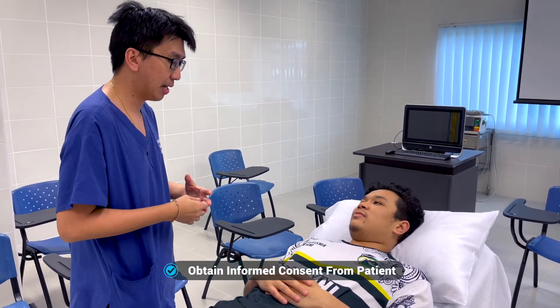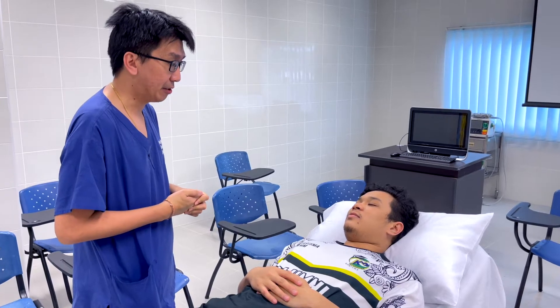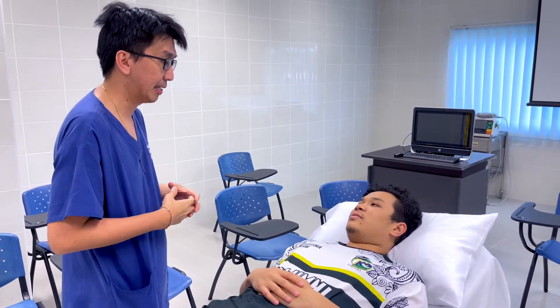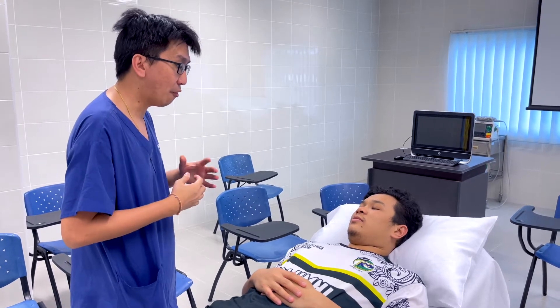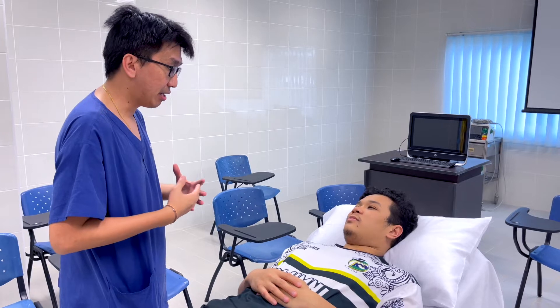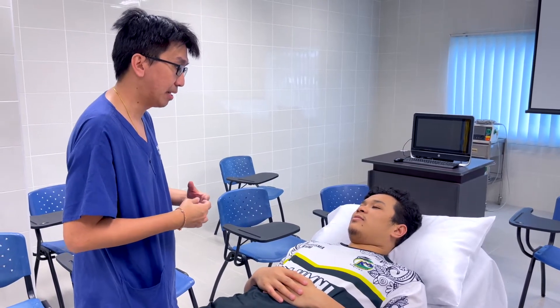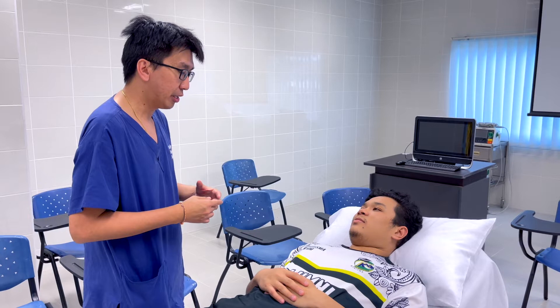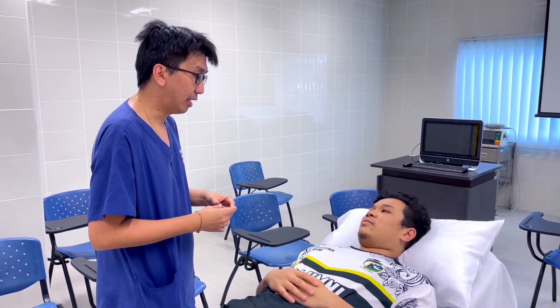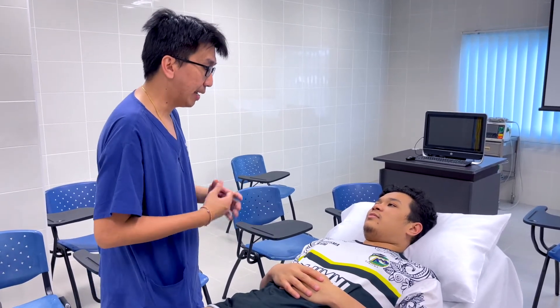For a lumbar puncture to be done — we suspect you of having acute bacterial meningitis because your signs and symptoms are pointing towards bacterial meningitis. To confirm the diagnosis, we need to perform a lumbar puncture. This involves inserting a spinal needle into your back, which I will show you shortly.